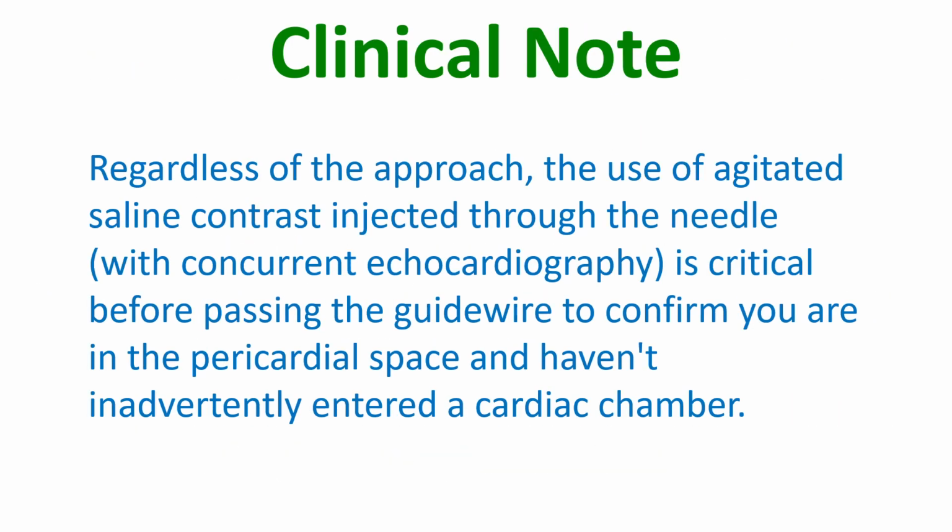Regardless of the approach, the use of agitated saline contrast injected through the needle with concurrent echocardiography is critical before passing the guide wire to confirm you are in the pericardial space and haven't inadvertently entered a cardiac chamber.